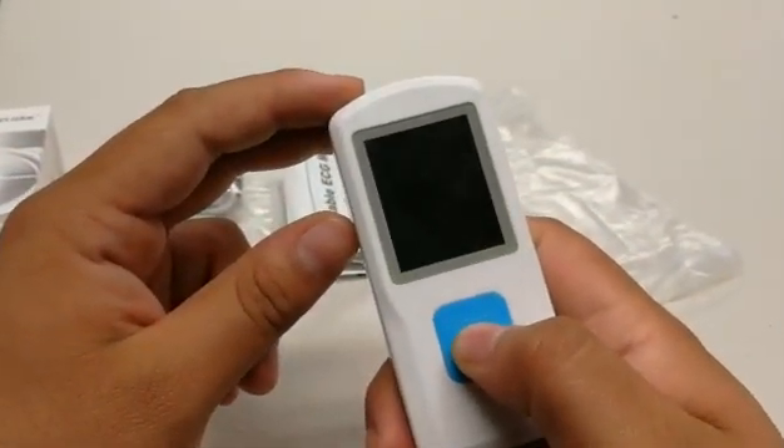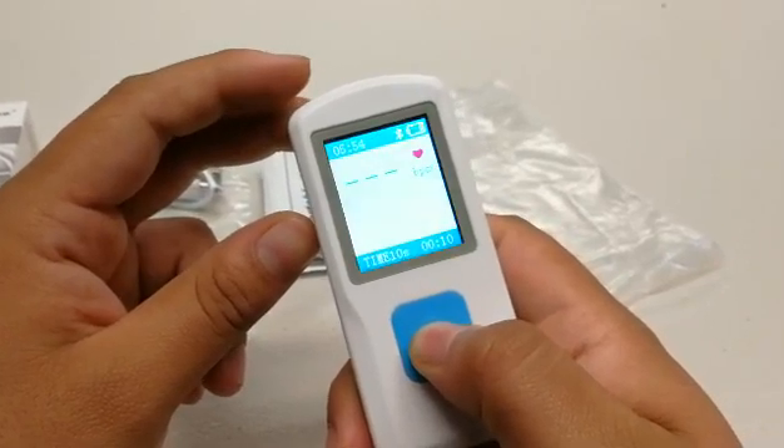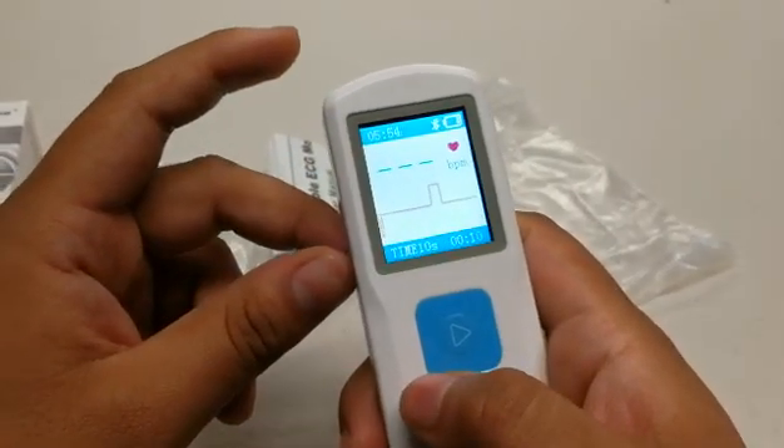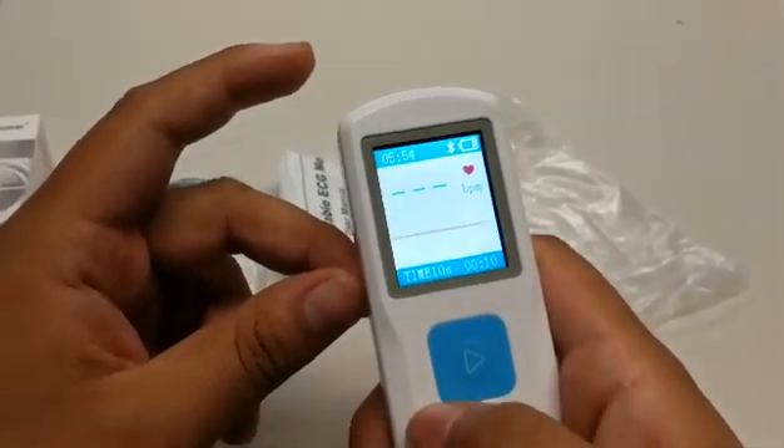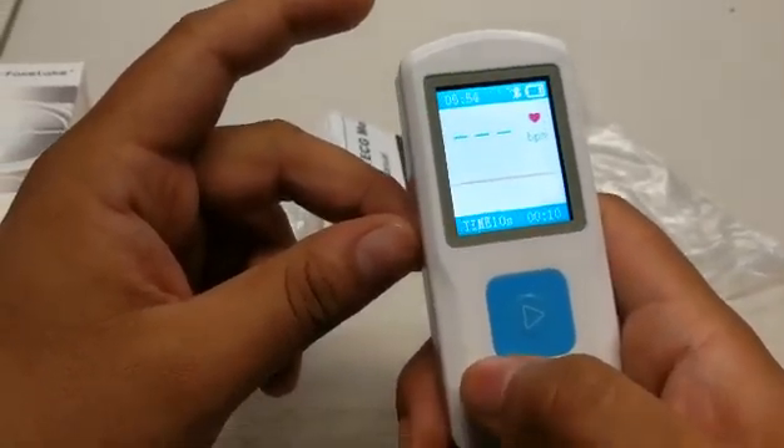To get started, hold down on the power button — this will initiate the device, which has a 10-second timer that will give you a 10-second reading.